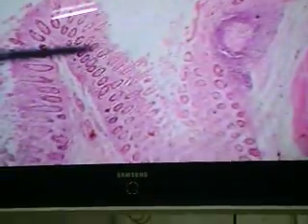So move now from small intestine into large intestine. My magnification always seems to be going. Okay. So we're going to be moving now from small intestine into large intestine. And we're going to see the preponderance of goblet cells. Okay, lots of goblet cells.